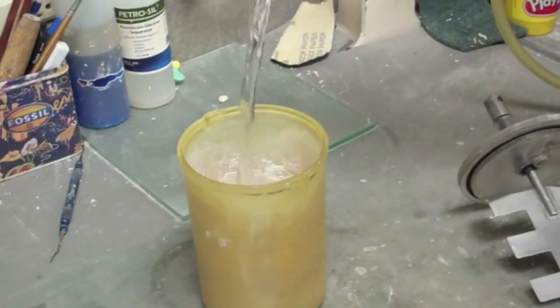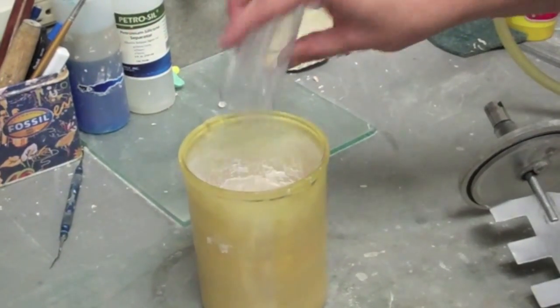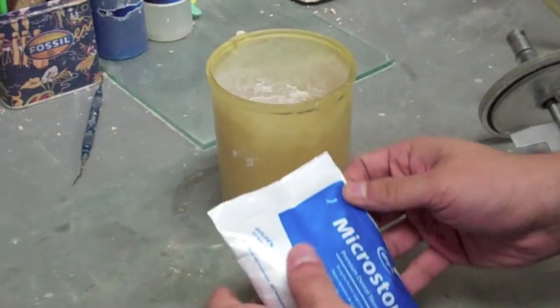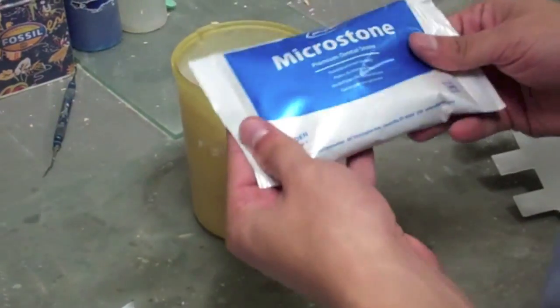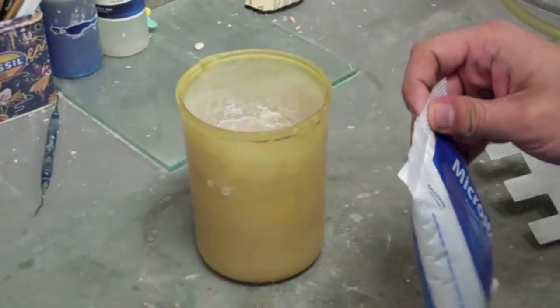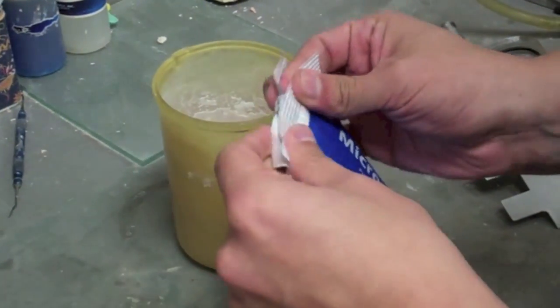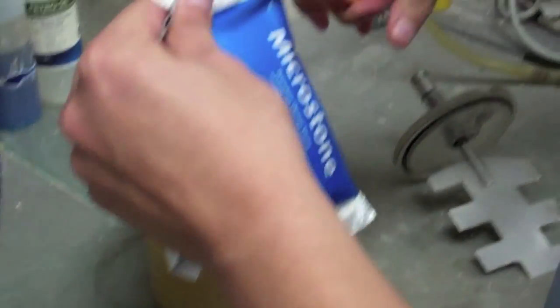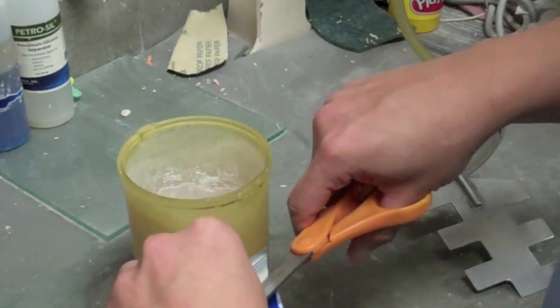Next, you will pour 40 cc of water into the Wipmix bowl. It is important to remember that measurements vary depending on the manufacturer. In this case, we are using 140 grams of stone for every 40 cc of water. After the proper amount of water is added to the bowl, you will now insert the stone.